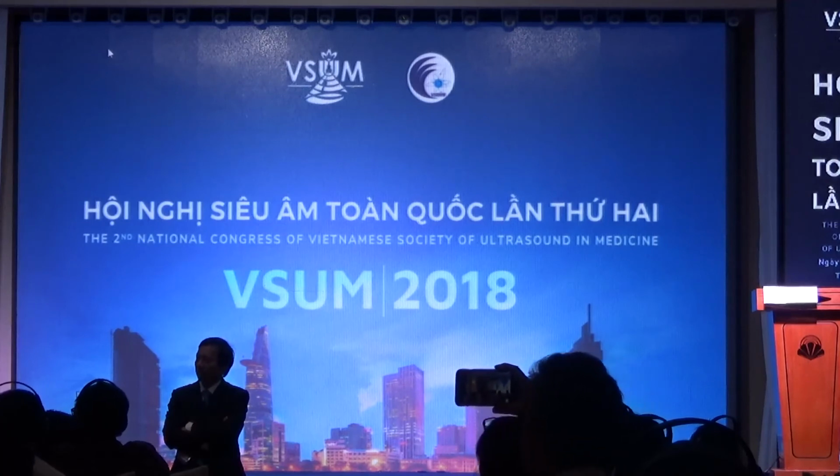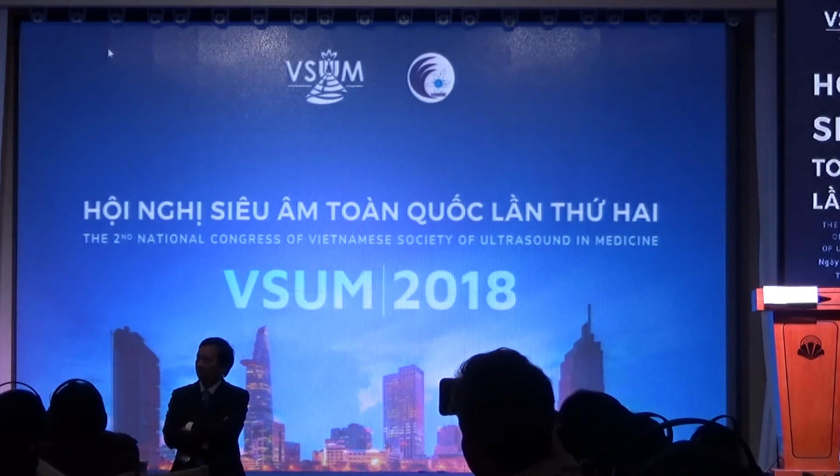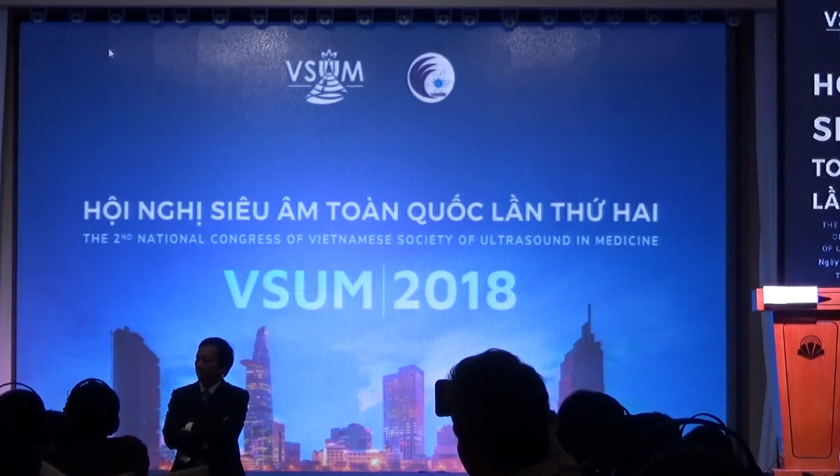So the new gold standard for any kind of comparison will be FibroScan. This does not mean at all that FibroScan is correct or not correct. At least it has been compared with liver biopsy.